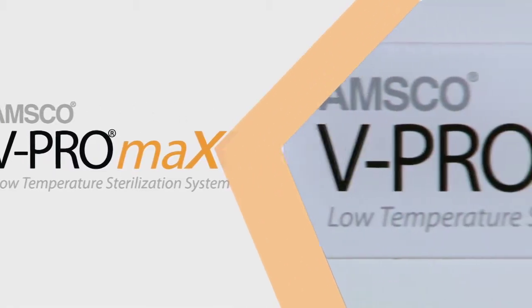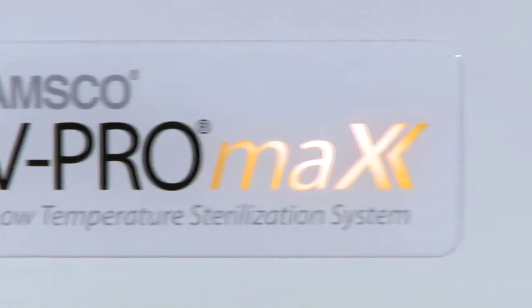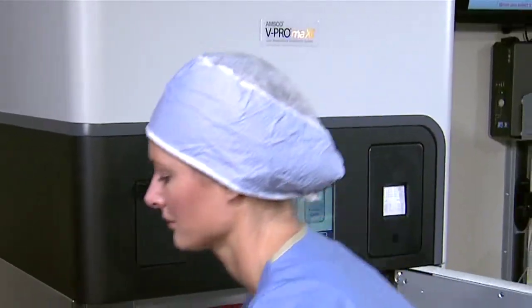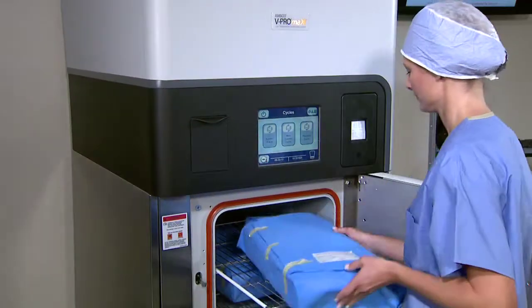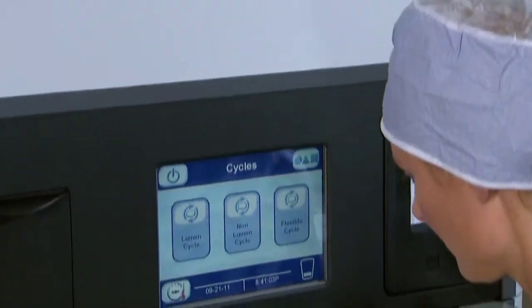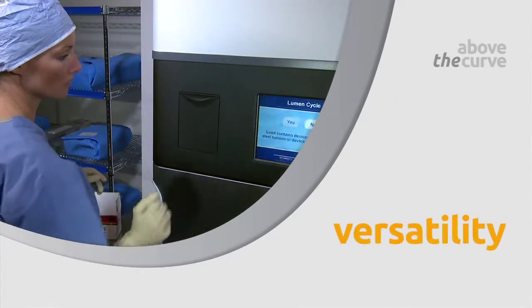Maximize your processing performance with the new AMSCO V-Pro Max Low Temperature Sterilization System from Steris. With its productive flexible cycle and an intuitive user interface, we designed the V-Pro Max to be above the curve in versatility.